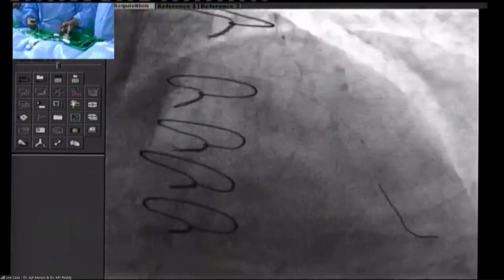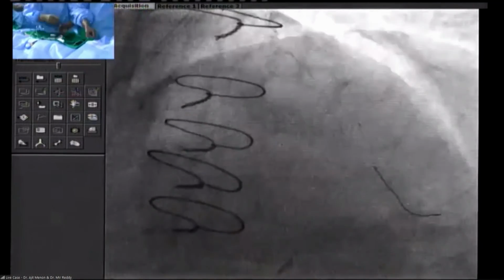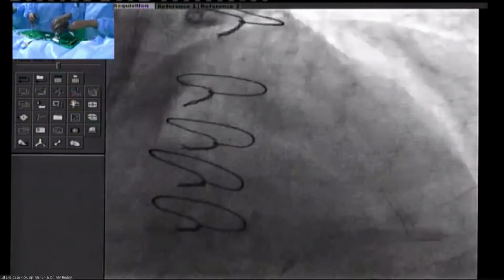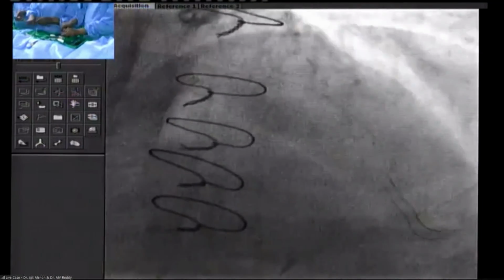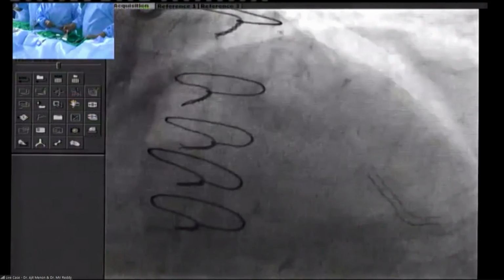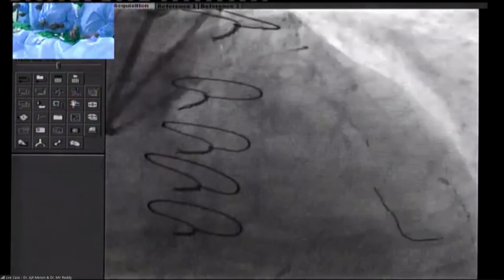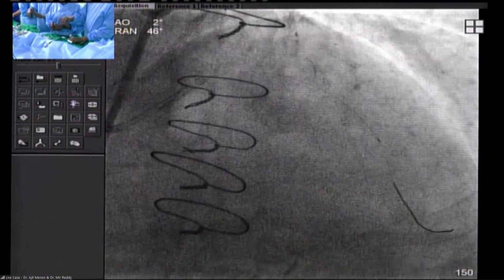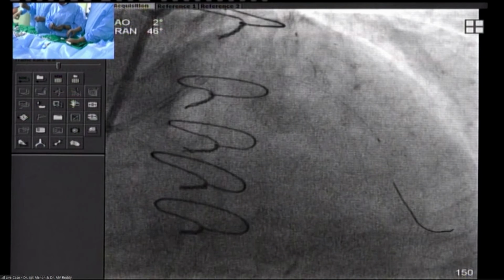But at that point of time, we were more keen on trying to stabilize him. Yeah, but the wide QRS and the near arrest status is more consistent with something going on with the Lima than the diagonal. I just don't know. The whole thing's bizarre. Nicoran, please, intracoronary.